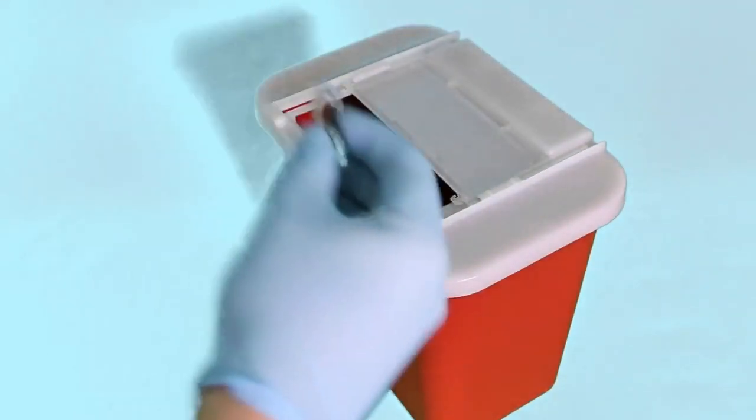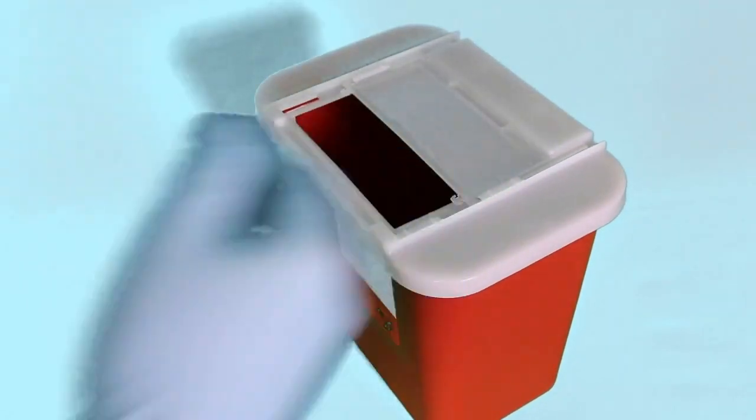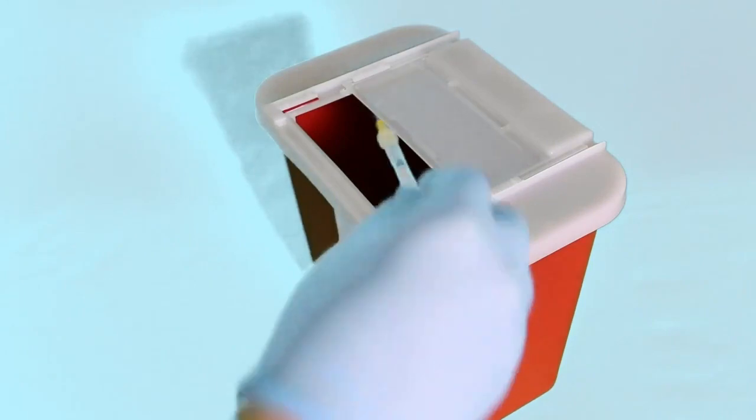When done, discard the broken ampoule and used syringe into a sharps container. Again, this is not the ideal method for a response to an anaphylaxis emergency, but when autoinjectors are unavailable, it is good to understand the alternatives and how to administer them.